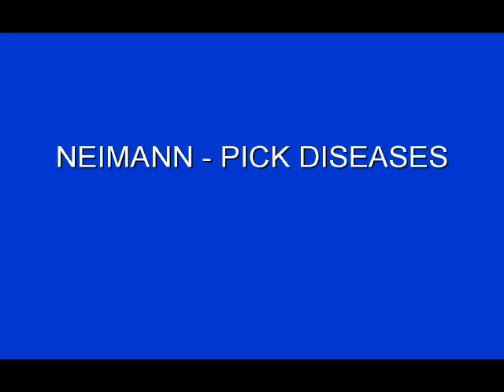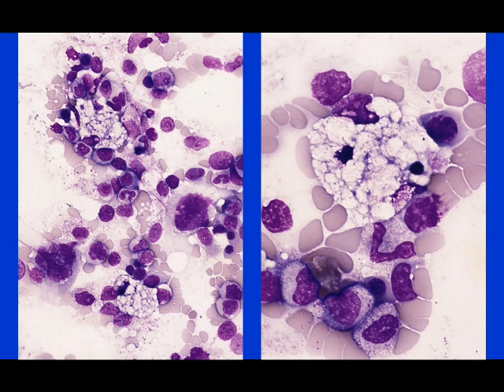All right, let's look at patients with Niemann-Pick disease. Now, these aren't as specific. The Niemann-Pick cells are foamy histiocytes, but they don't have a distinguishing feature that differentiates them from foamy histiocytes you can see in a lot of other conditions, including some patients with hyperlipidemia, where we'll see foamy histiocytes in the marrow.